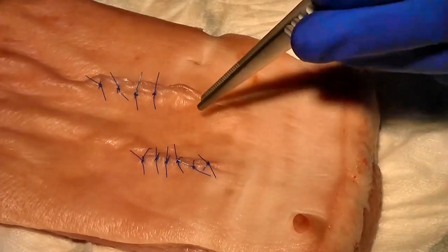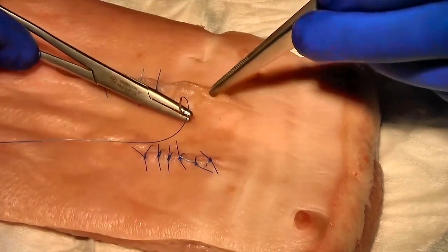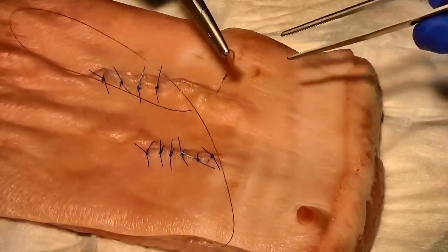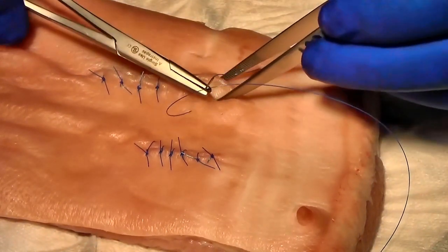Finally, I want to show you about the tension of the sutures. The aim of a skin suture is to bring the edges of the wound together gently with a good blood supply and no tension.